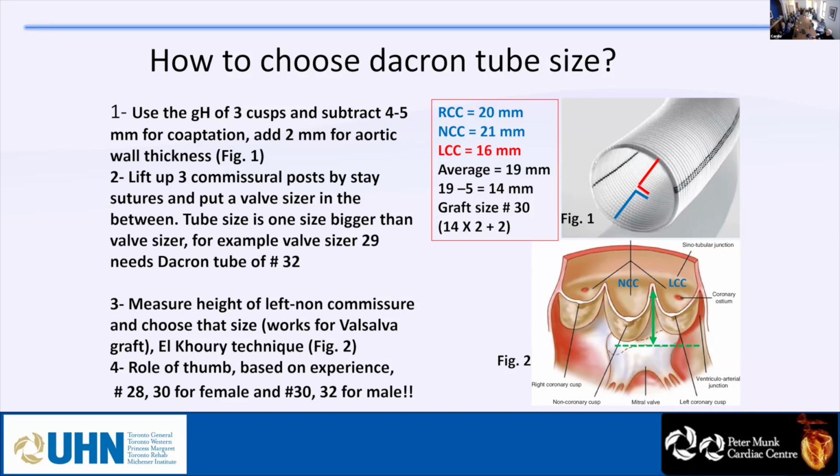So that measurement, the surgeon can do as well, but we can do it before for the surgeon. If the leaflet length, the geometric height, is not enough, less than 1.6 or 1.8 centimeters, that valve is retracted and is not good to be preserved.